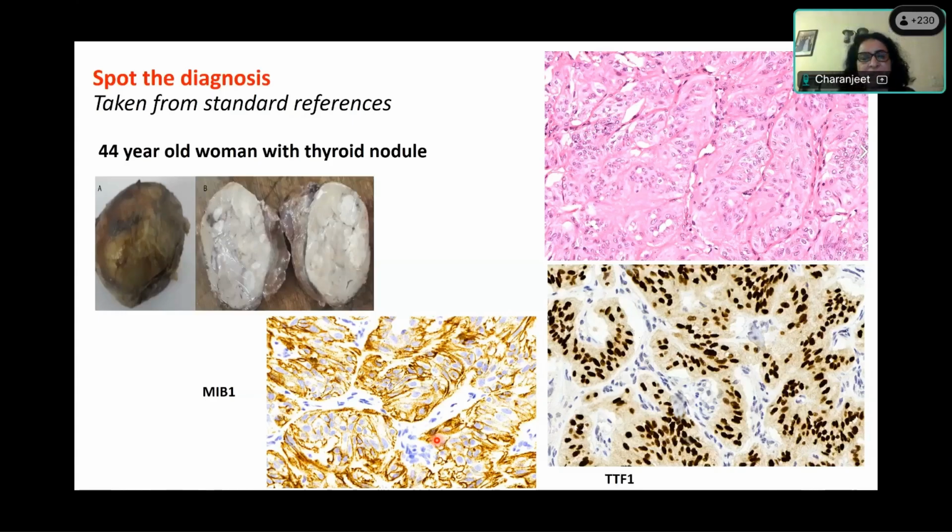Now this is a tumor that arises from the follicular cells of thyroid. So this is a hyalinizing trabecular tumor. Look at this characteristic morphology: you have these nests, cords, or trabeculae. Then second, there is a lot of this pink material, which is hyalinization. That is why it's called hyalinizing trabecular tumor. The trabeculae and nests are separated by these blood vessels here.